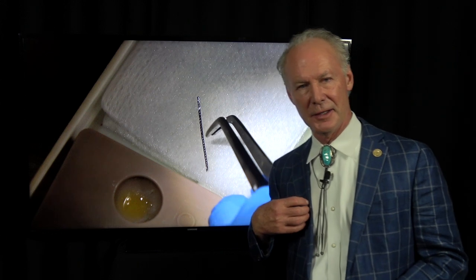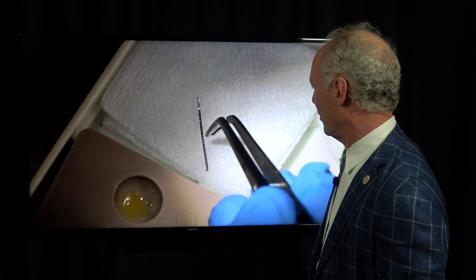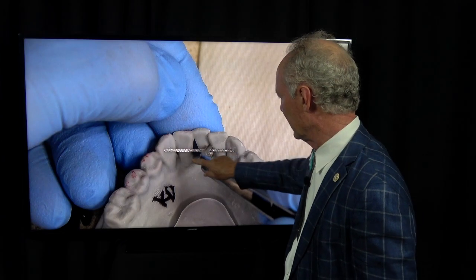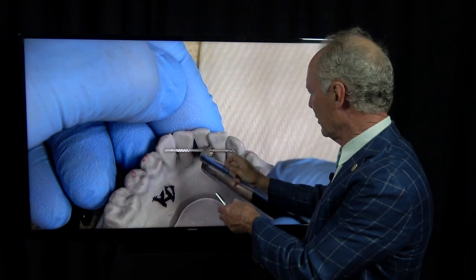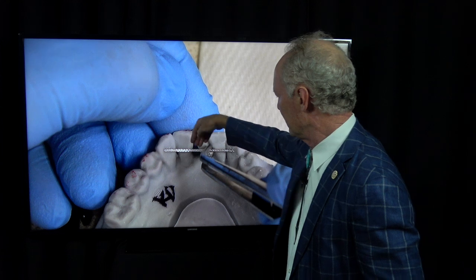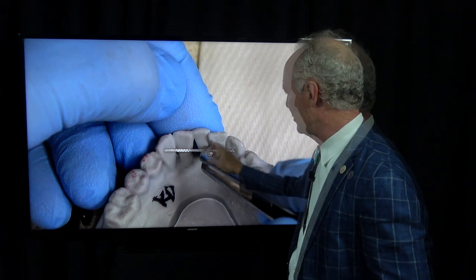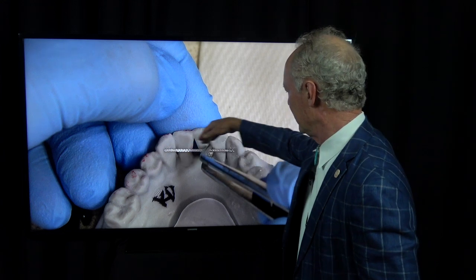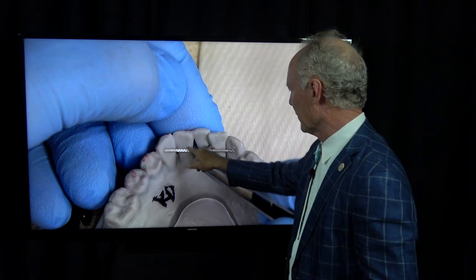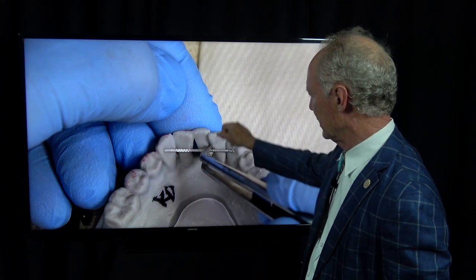So my feeling was a deep cleaning, a lingual bar, three-month recalls, and good home care was appropriate for this patient. Now, I'm not an orthodontist, so I'm not as good at this as orthodontists are, but I watched YouTube videos and my assistant and I placed this lingual bar. This is just orthodontic wire — you start with a model, put it on the lingual of the lower anterior teeth, press it in and form it generally to the teeth. You can see there's some crowding, so you may polish a little of the lingual with a football diamond to smooth out any divergence. Get the length and get it approximately correct.